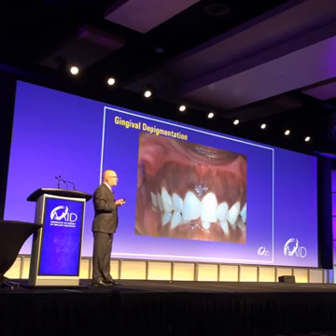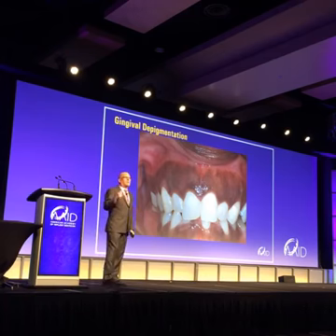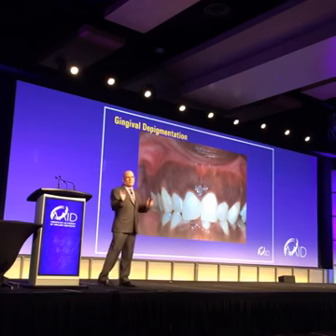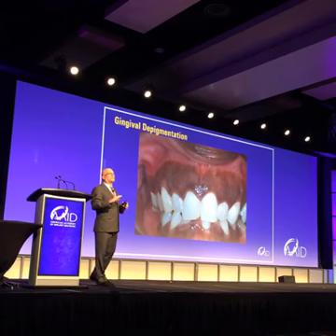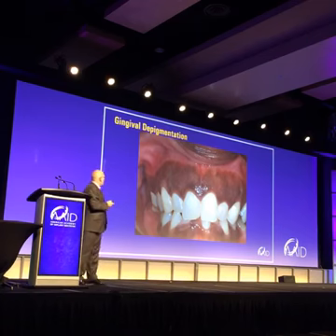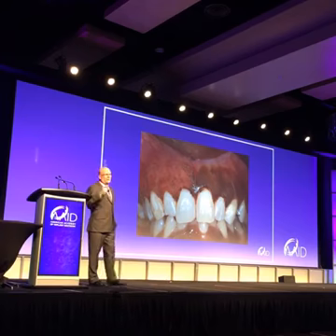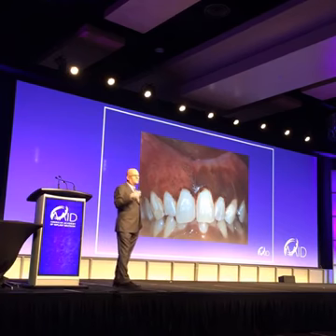I said, okay, well, we'll treat it with my laser, because the other option that you got from another periodontist was we'll take a diamond bur and strip away your outer layer of gum tissue and then maybe graft some tissue on top, which sounds absolutely brutal. So we treated her, this is what she looked like. I did half her mouth because she only paid half the fee. So this way you know they're going to come back and get the other half treated.